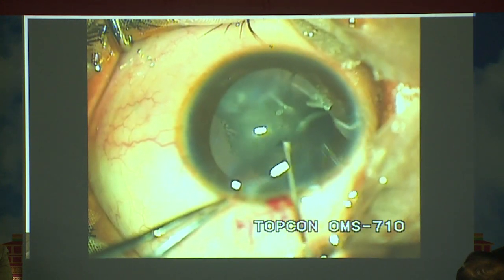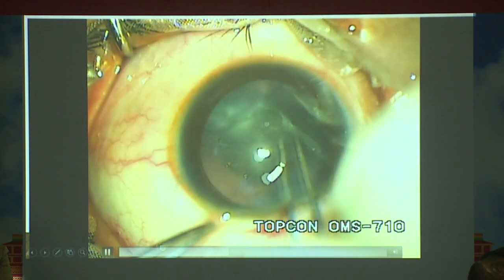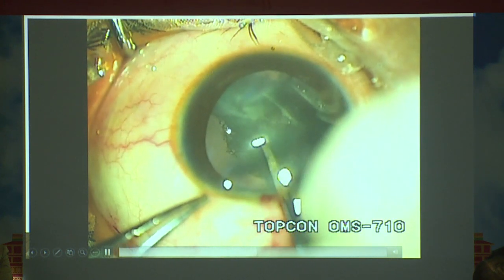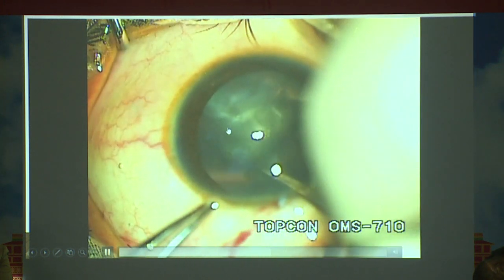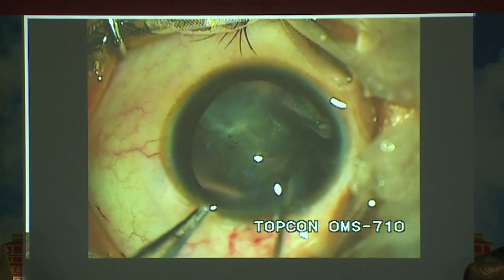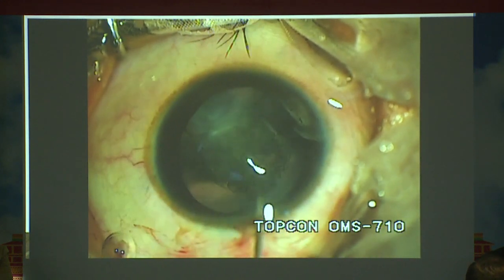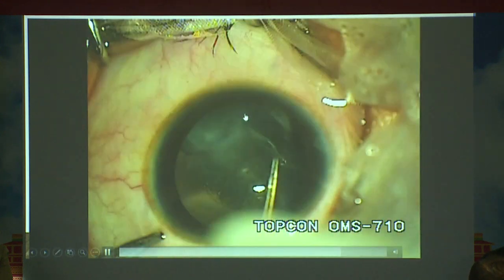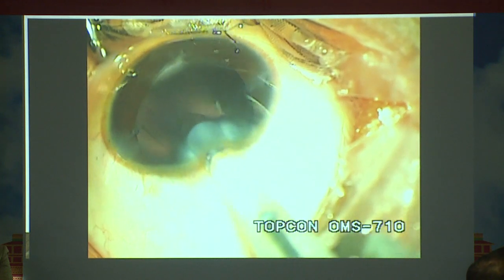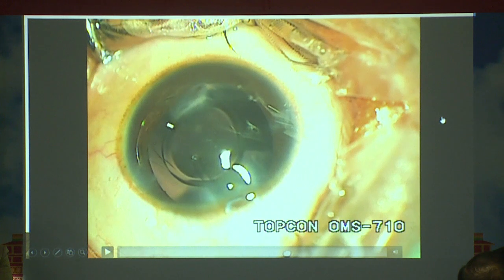So we went ahead, and what I was trying to do is a rhexis, keeping the torn anterior capsule underneath. I left this torn anterior capsule and did a circular rhexis, so that once you get the rhexis clear enough, round enough as a CCC, you can go about slowly and take out the cortical matter. Be careful, and you can still put the IOL inside the bag in these cases.